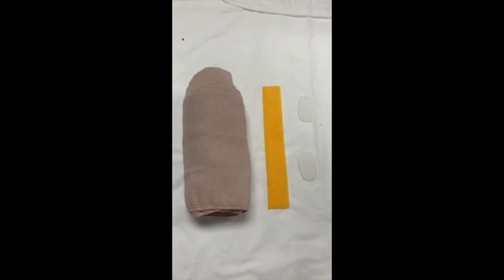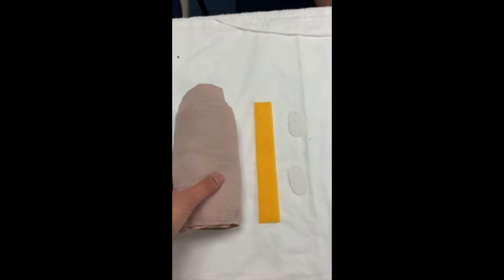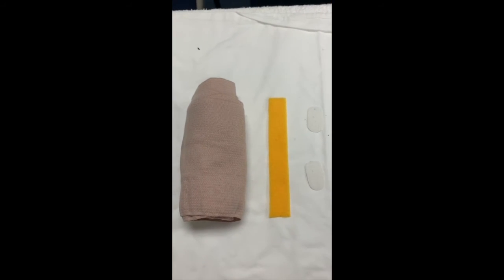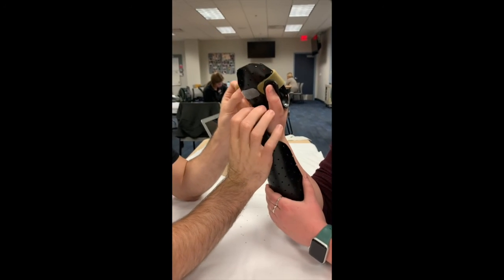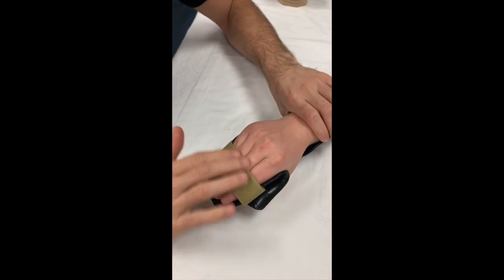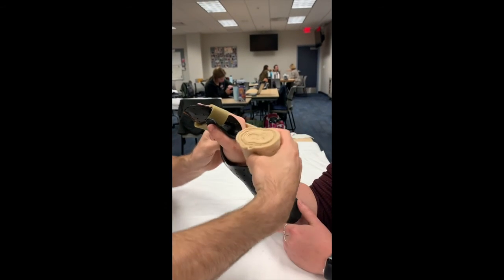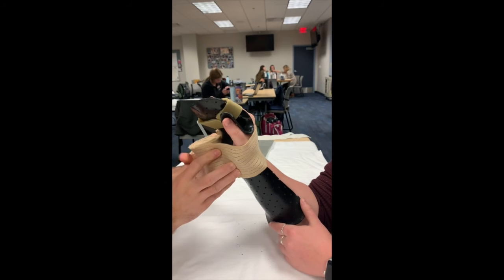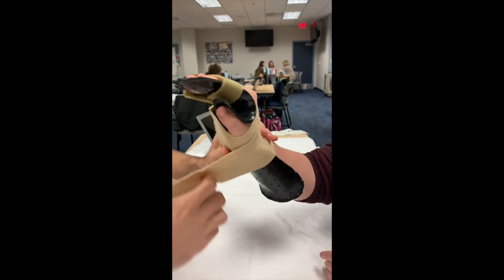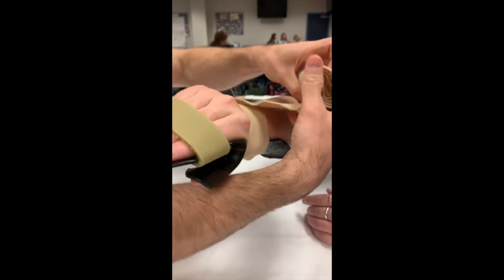Due to the nature of the acute injury, the strapping that would be required is an ace bandage and a small strap to keep the thumb piece in full extension. Strapping. Place the strap over the thumb piece to promote full extension. Due to the acute stage of the injury, strapping is not required for the wrist and forearm. Therefore, the therapist will place the ace bandage circumferentially, covering the hand all the way down to the forearm.